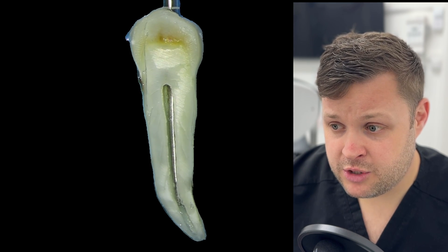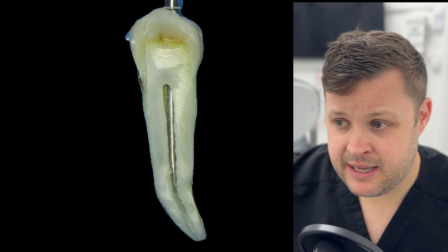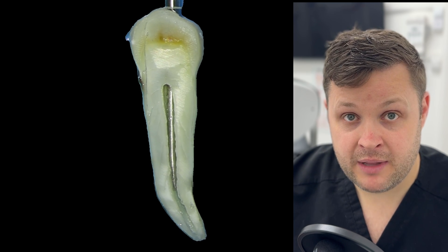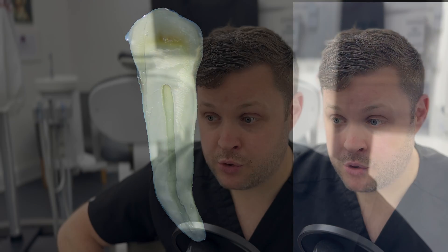The second thing we're going to do is get our heated plugger and guesstimate where about five millimeters away from the apex it fits, because that's significant — that's how much you're going to push down into the canal to condense this apical GP plug.